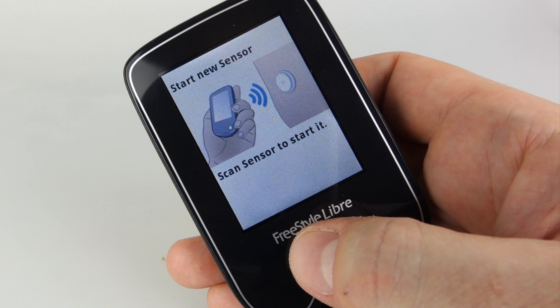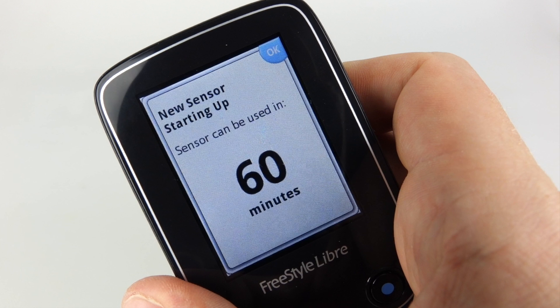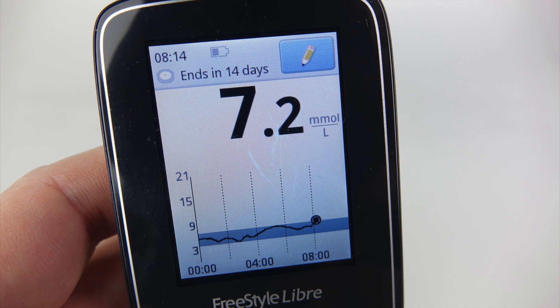You get your little reader out, press the button, and it says 'start new sensor.' You scan it on the sensor — it says you can't use it for at least 60 minutes, but it registers that the sensor exists. After 60 minutes you can get a reading from it. Notice at the top it tells you how many days you've got before your sensor ends, and there's a little graph at the bottom there as well.